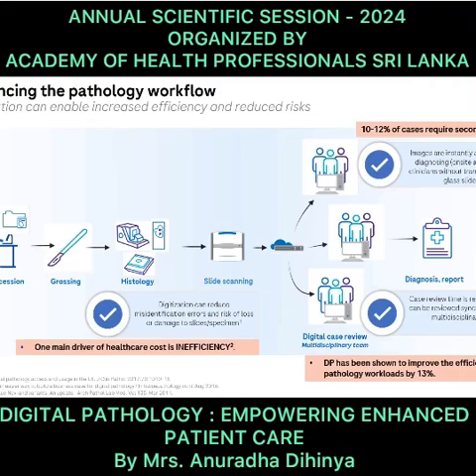And now, what is the benefit when we go for digitalization with the scanners? The good part is that the cases don't need to go out. The patient doesn't need to carry those slides to any international firms or hospitals. Those images can be immediately transferred for a second opinion with the help of the scanners.